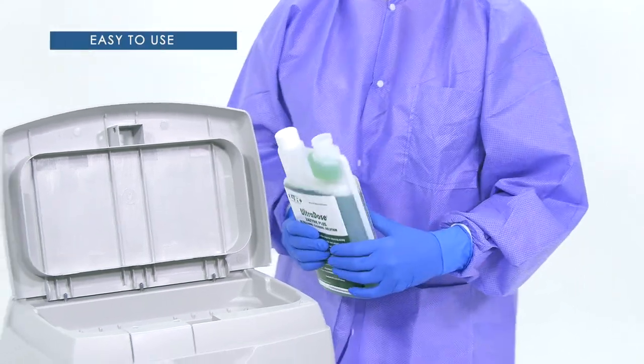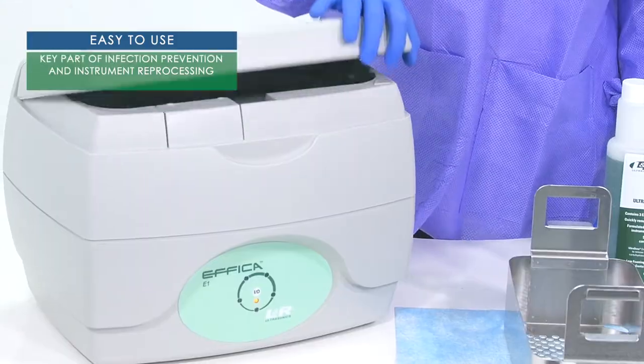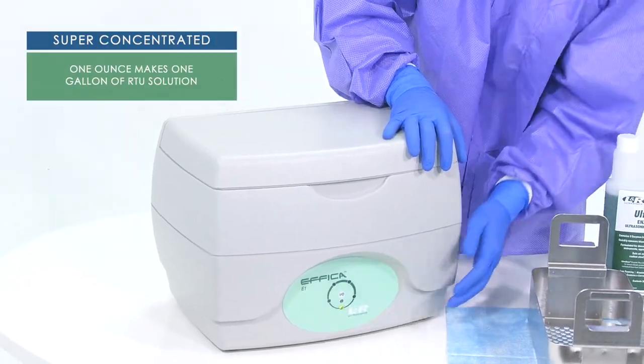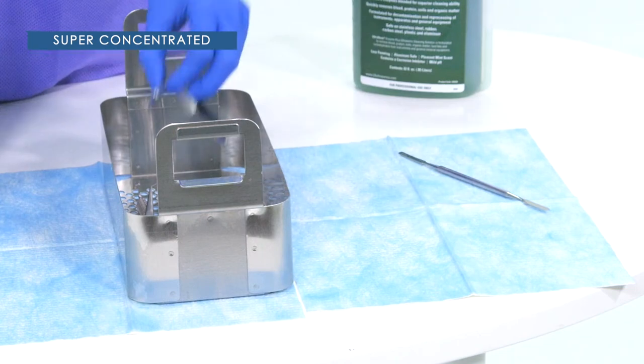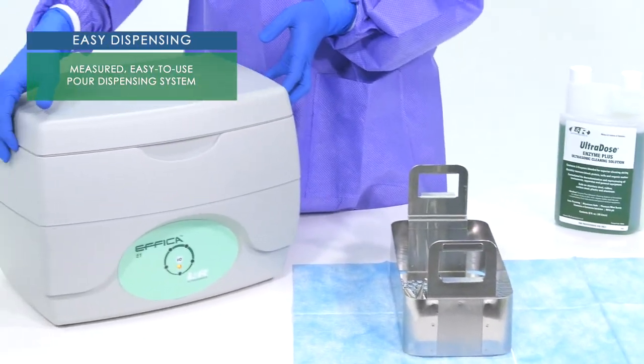Ultradose Enzyme Plus is extremely easy to use and is vital for infection prevention. The super concentrated solution has a ratio of one ounce per gallon of water, making 32 gallons, and can easily be dispensed with the easy-to-pour system.